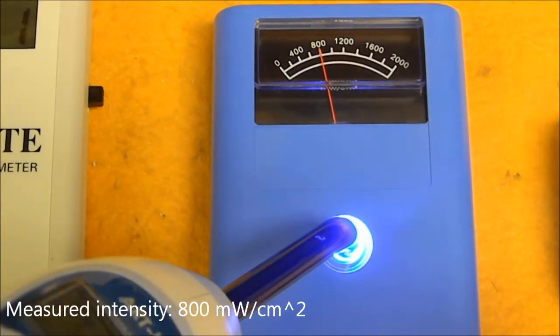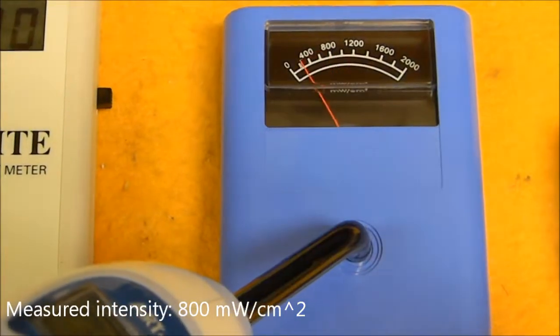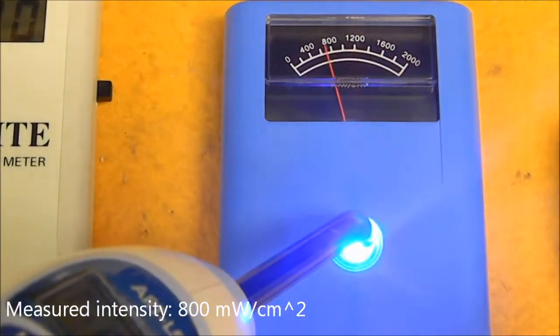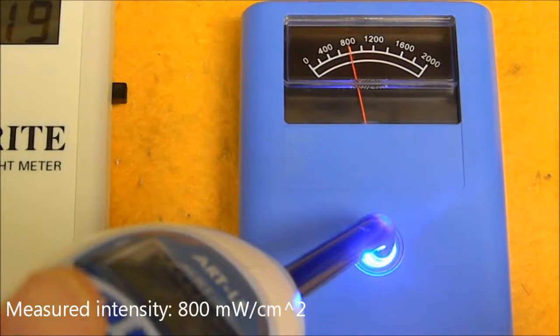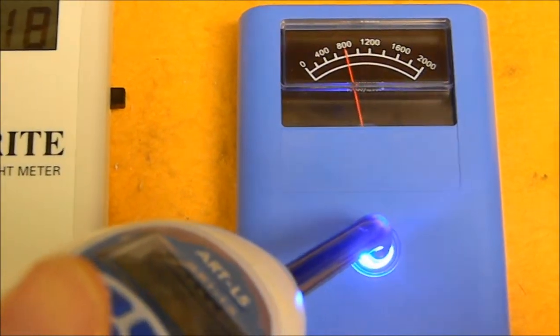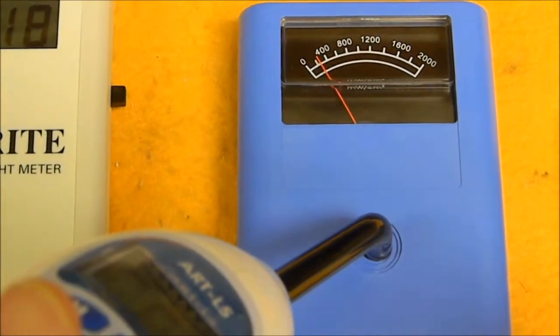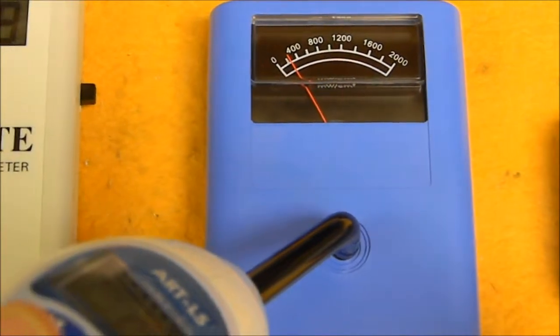As you can see, we have a power reading discrepancy of around 1000 milliwatts per centimeter squared. While a reading of 800 is considered high output by this particular radiometer, it is a drastically different reading than what is provided by either the Mark system or the Densply unit.